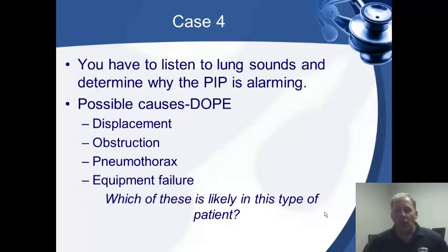You listen to the lung sounds. You've got a high peak pressure, so you have to consider the DOPE mnemonic. Do we have a displaced tube? Do we have an obstruction? Do we have a pneumothorax or an equipment failure? If I listen to his lungs, I can probably tell right away whether I have a pneumothorax. Listen closely and compare both sides.